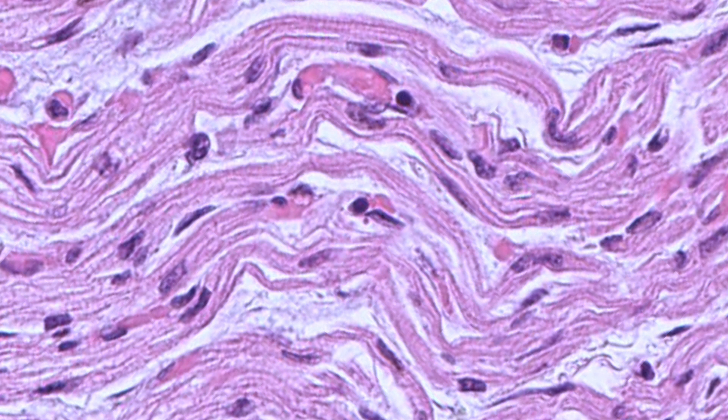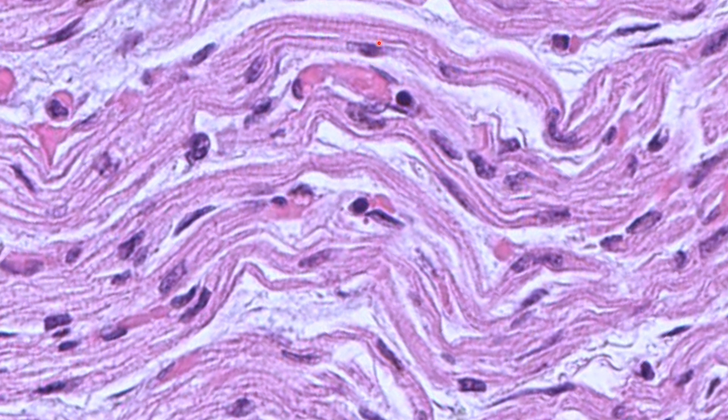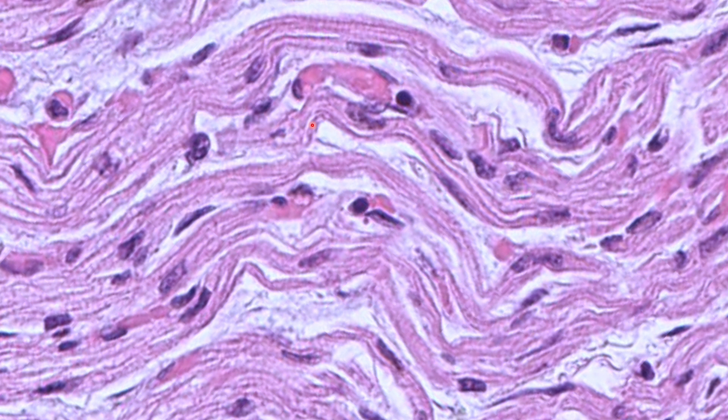Now, smooth muscle is your leiomyoma. The last but not the least is skeletal muscle, which is actually one of the easiest. This is from a cardiac rhabdomyoma adjacent cardiac muscle structure. The nuclei as usual will be elongated — be it normal striated muscle, rhabdomyoblast, or rhabdomyosarcoma — but what is more important is striations. This is an oil immersion image which is why it looks a bit blurred, but only in oil immersion can you see the striations clearly.